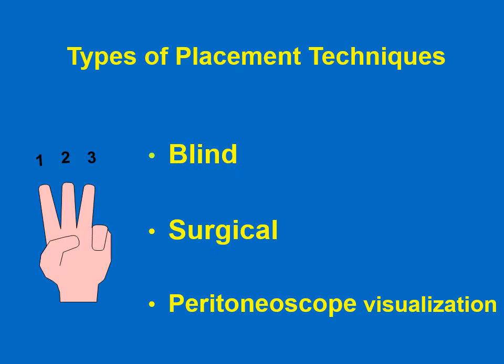To insert the peritoneal dialysis catheter, actually we have three techniques. I will try not to go into the details or depth of these techniques. However, I think it will be interesting for you as a nephrologist to know about these techniques, even the surgical technique. We have the blind technique, the surgical technique, and the peritoneoscopic visualization technique.